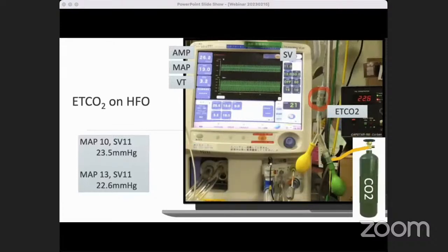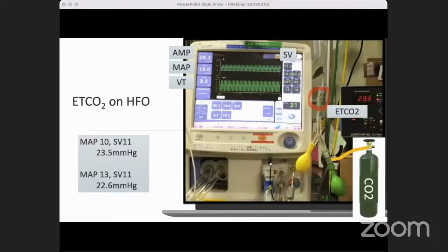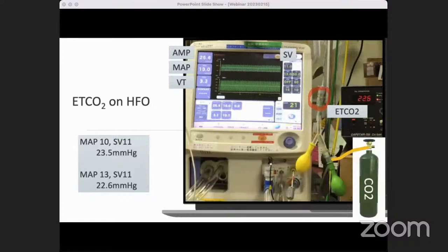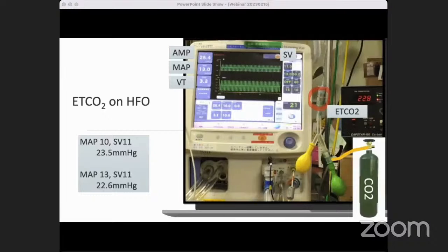In actual patients, we expect to improve oxygenation by increasing MAP, and increasing MAP improves lung compliance. This result shows that setting MAP to an appropriate value improves oxygenation, but also improves ventilation because tidal volume improves as compliance improves. Even the slightest change in tidal volume will decrease CO2 concentration.